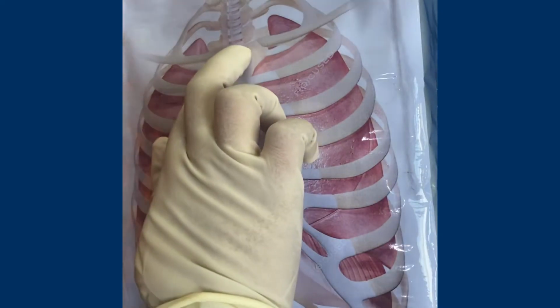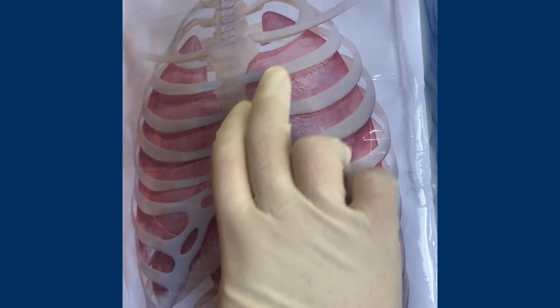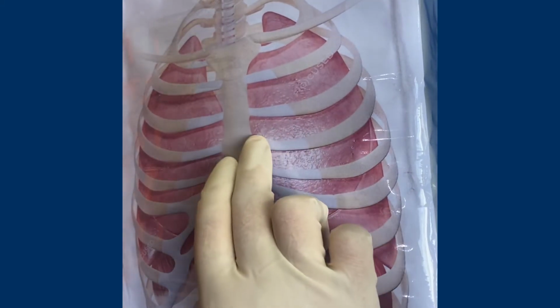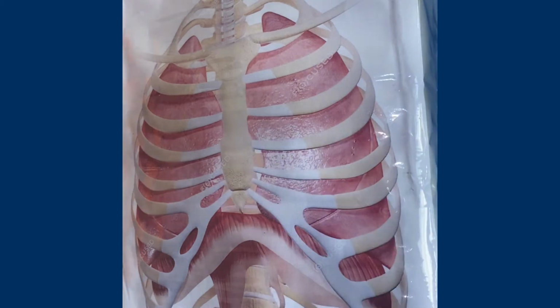Identify the fourth or fifth intercostal space at the anterior axillary line at the site of injury. Identify the sternal angle. The structure adjacent to it is the second rib and their intercostal space. From this location, move downward to locate the fourth or fifth intercostal space.